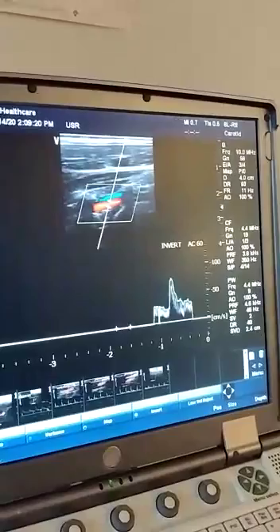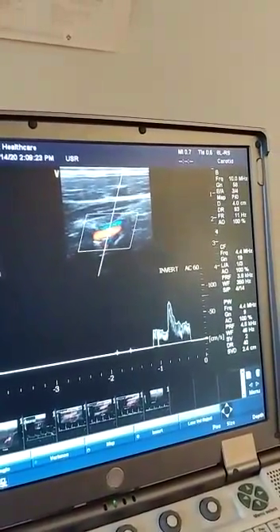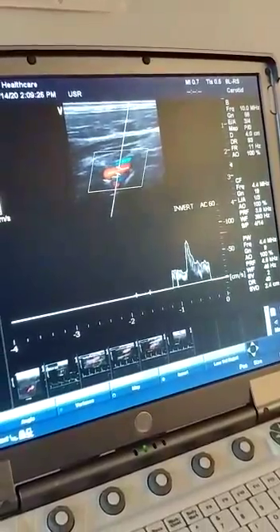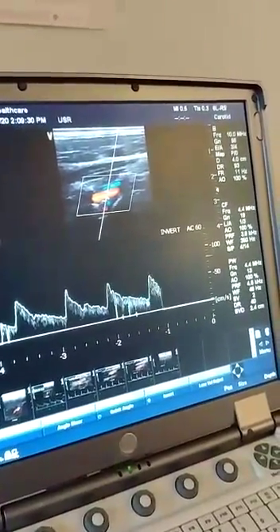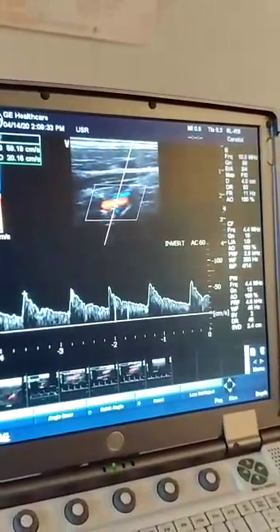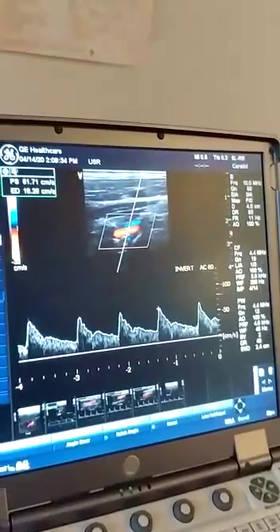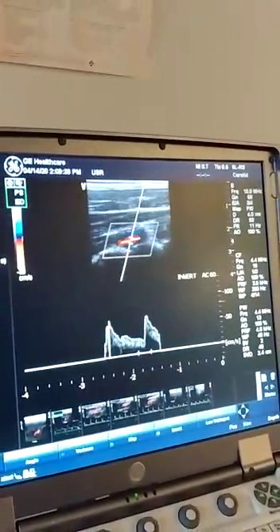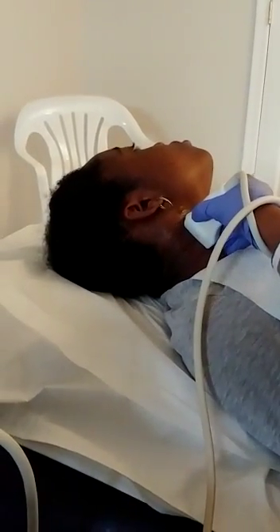I always recommend that if you're scanning a carotid artery, get your vertebral artery at the same time. You want to go ahead and angle back towards the back of the patient's head. The reason is you are able to identify retrograde vertebral flow if there is retrograde vertebral flow. I'm going to go ahead and obtain a waveform of the vertebral artery and store that image. When scanning your vertebral artery, keep your CCA in view and slowly angle towards the back of the patient's head.